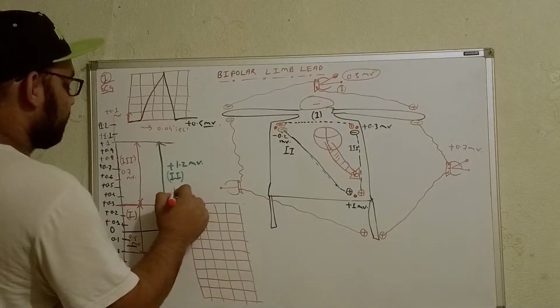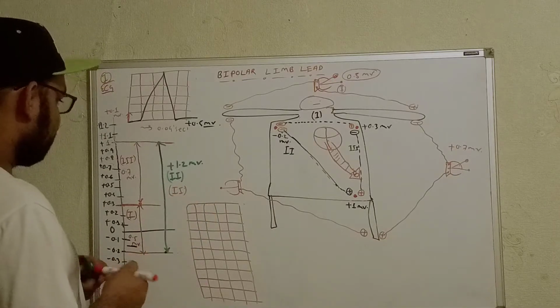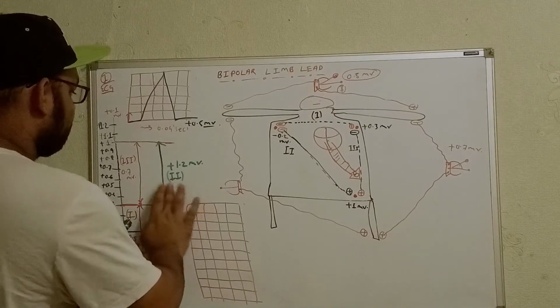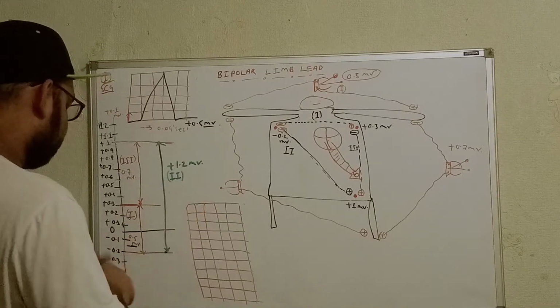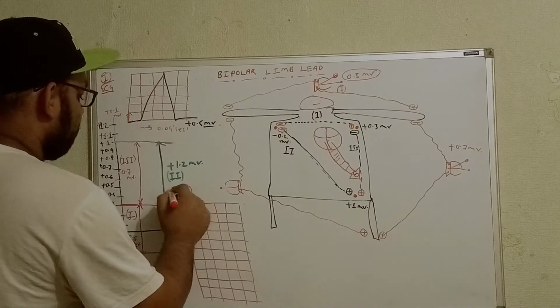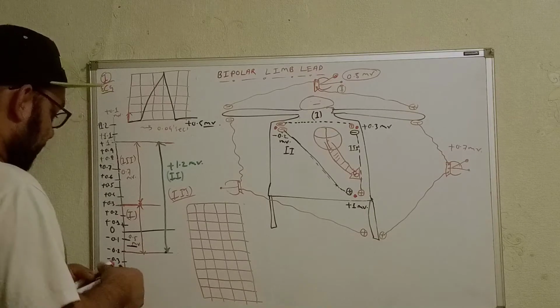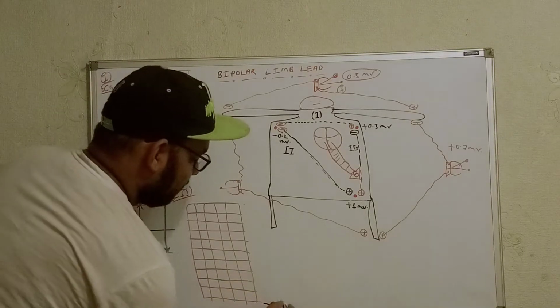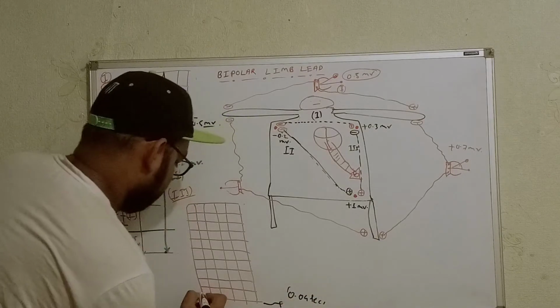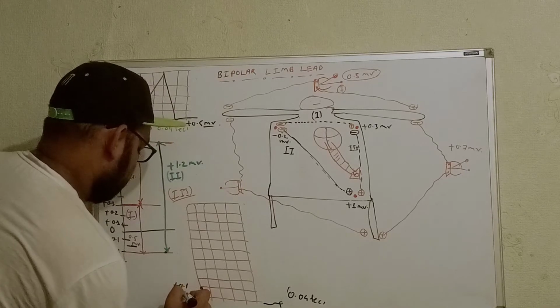Now if we take in terms of lead number 2 over here, whatever we will get in this way. Now see, the potential difference in terms of lead number 3, sorry, I am just considering lead number 3 right now. If you want to represent lead number 3 in terms of ECG over here, so what can you get? Now see, we know that in this way you will get 0.04 second, and in the vertical you will get plus 0.1 millivolt.